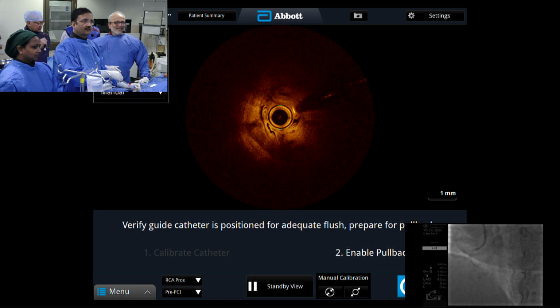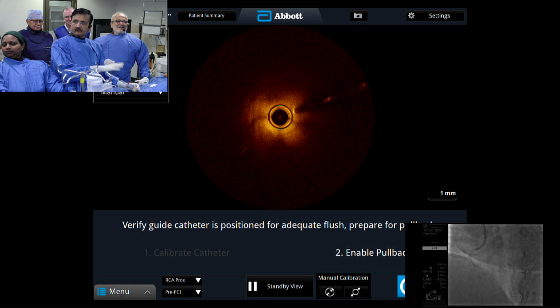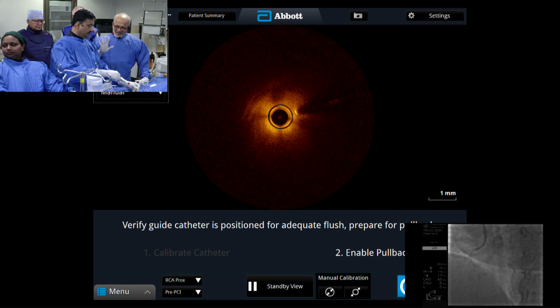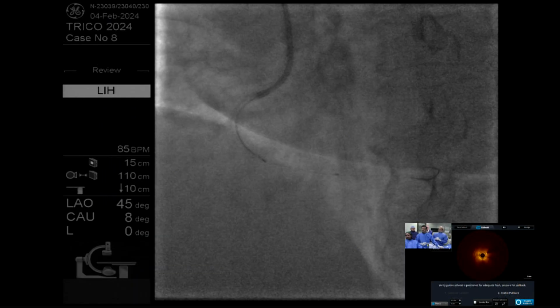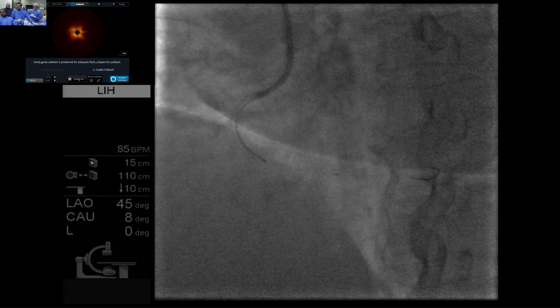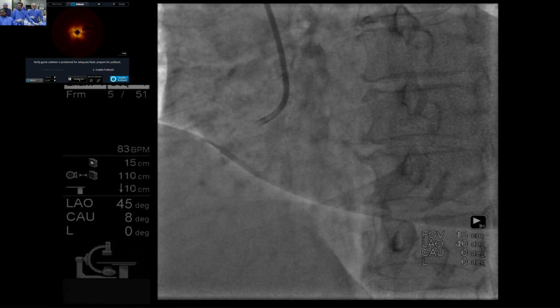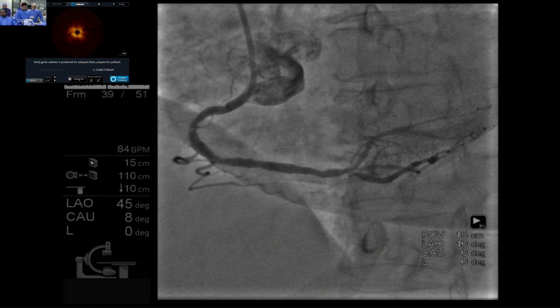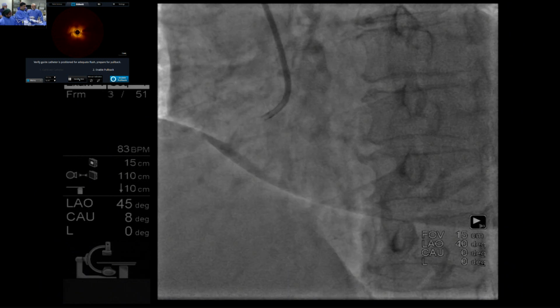Good morning, Tejas. It's Khalid Ziada. Khalid. Nice case. I tend to agree with you actually about the drug-coated balloons. I don't know where they will fit in practice, but we need a lot more data. I don't think we have good data on complex lesions like these. So for simple things maybe, but for calcified lesions, probably after you pre-dilate, there will be a small dissection. Maybe it won't be expanded. So I think it needs a little bit more work than just painting the walls, as you said.